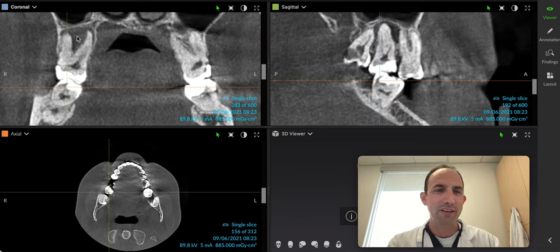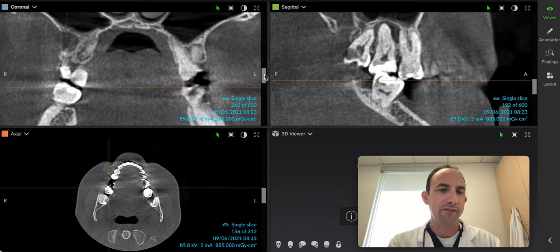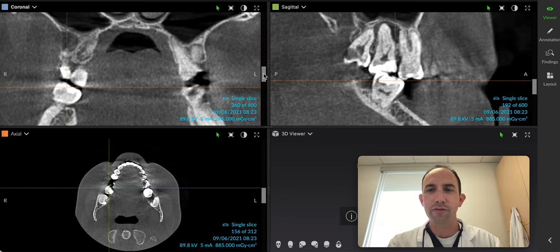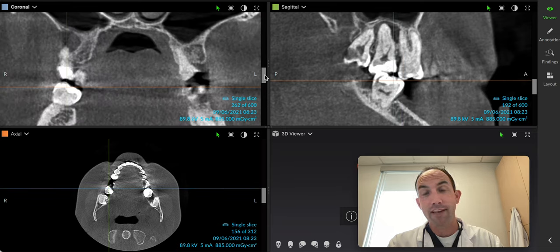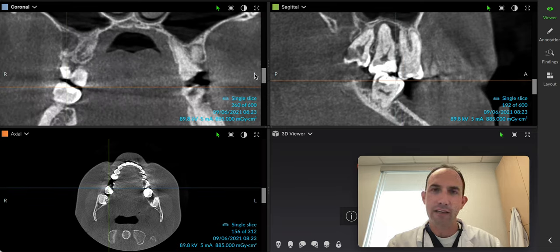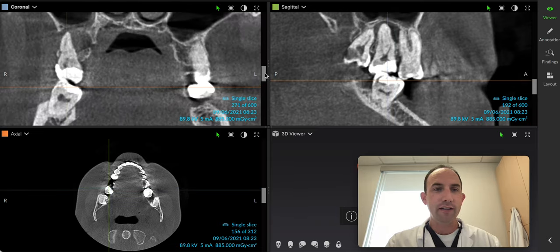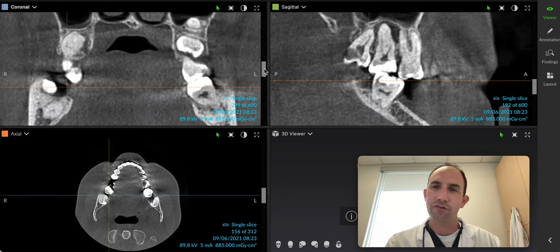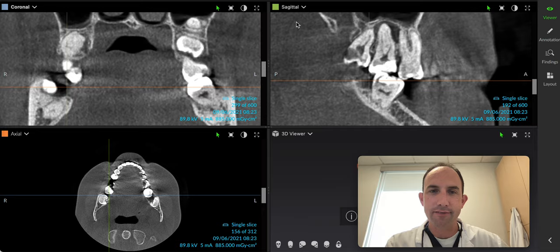Instead of just a panoramic — look at that — you can see how extensive that abscess is. As we come to the mesial, you can see it's definitely connected on the distal root of tooth number three. Take a 3D instead of just a panoramic, if it's indicated and on adult patients in the correct indication, because it just gives you so much more data, so much more detail. It really takes our diagnostic ability up to the next level. Thanks.